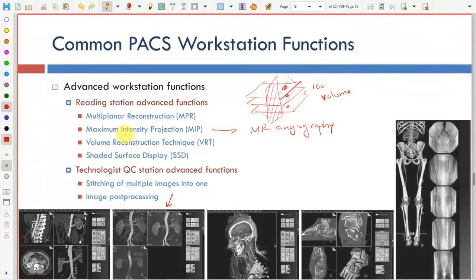if you do the maximum intensity projection, for each one of the images, you project in a certain direction. I usually project a volume, the whole volume. Usually for all the advanced workstations, you're working with a data set that scans a volume like this. So if you have a very bright object here, okay, if you do a regular projection, then it will be added to things here that have nothing to do with it.